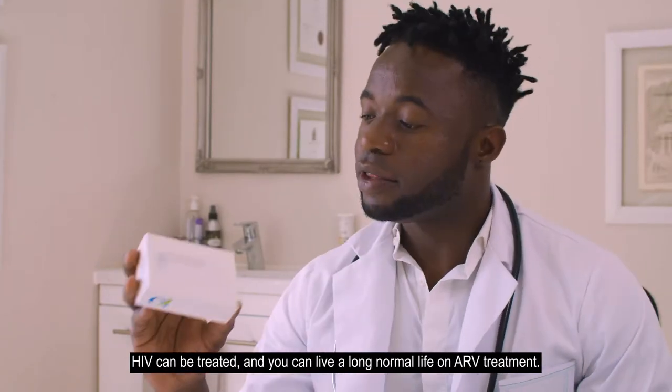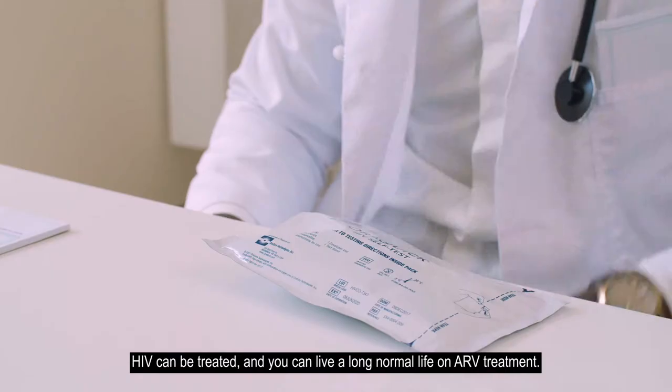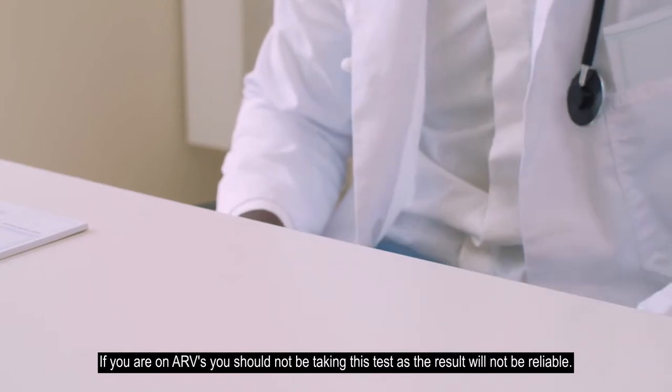HIV can be treated, and you can live a long, normal life on ARV treatment. If you are on ARVs, you should not be taking this test, as the result will not be reliable.